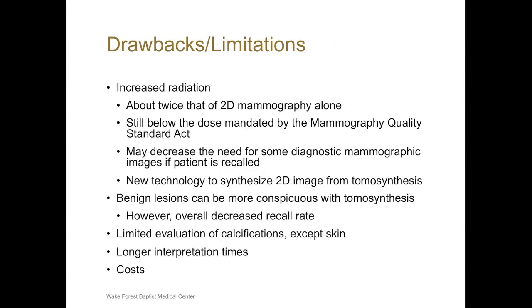But with every technology, there are also drawbacks or limitations. With tomosynthesis, we are using more radiation, about twice that of 2D mammography alone. But it's still well below the dose mandated by the Mammography Quality Standards Act.